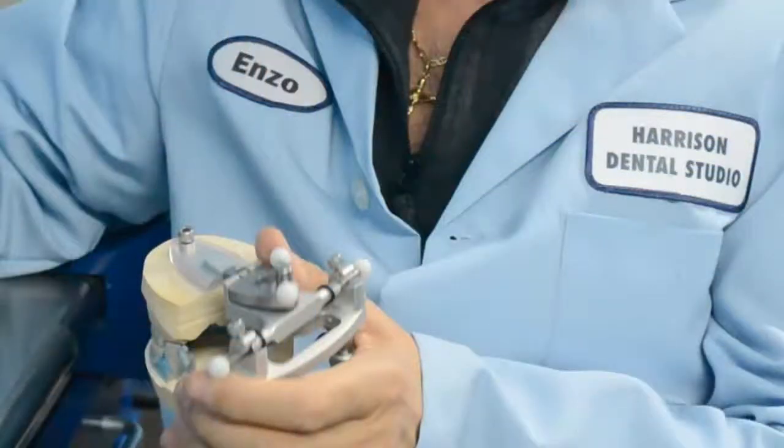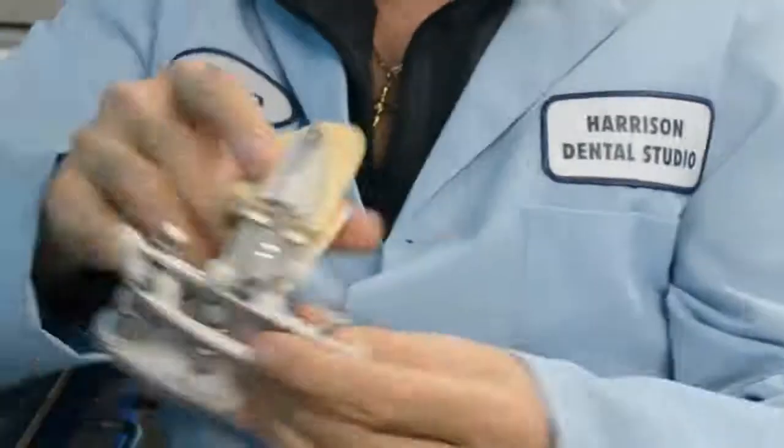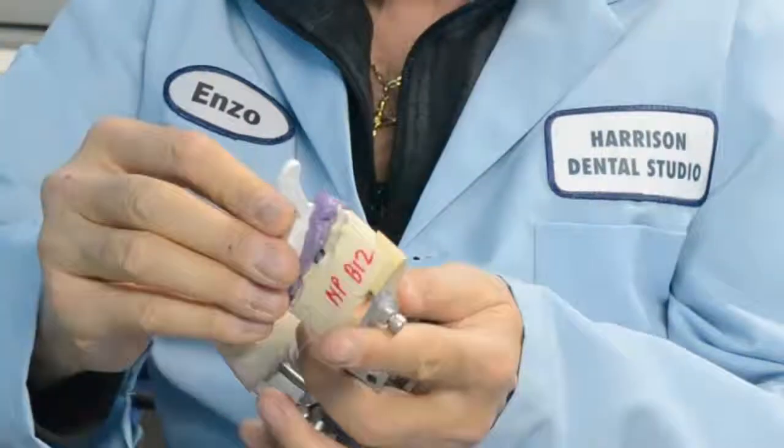It's a universal articulator. You can do quadrants, full arches, triple trays — anything. As long as you're able to glue the plastic female, you can articulate it, no matter what model system.